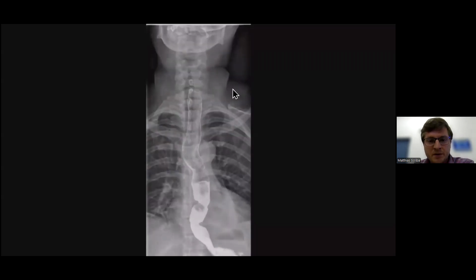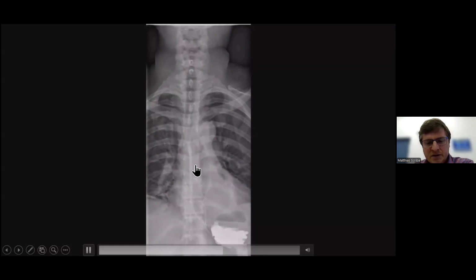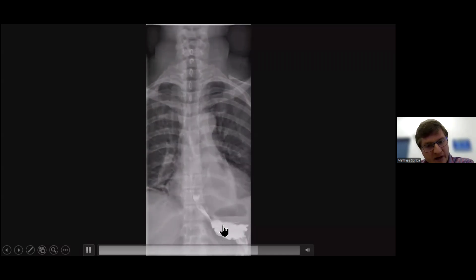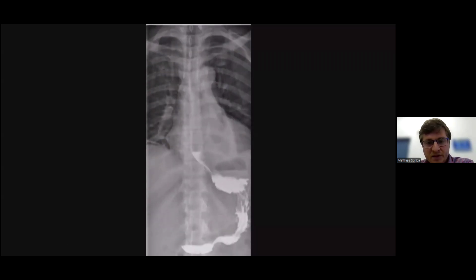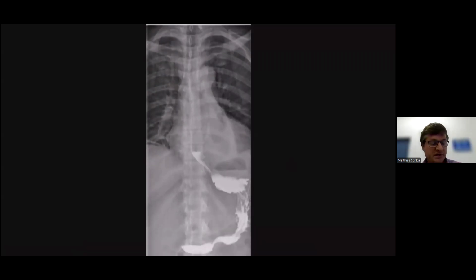There it goes. So the esophagus does look abnormal. It's slightly dilated. Certainly it does drain, so there's not a major holdup, maybe a bit slower. And there's definitely no classic bird's beak or rat tailing, although on this image you might now say, well, maybe that is a rat tail. Okay, but this is not screaming achalasia per se, but there's definitely a problem here.